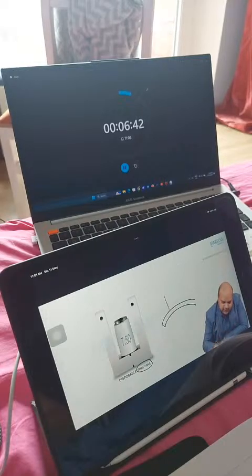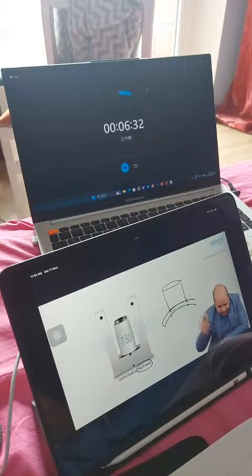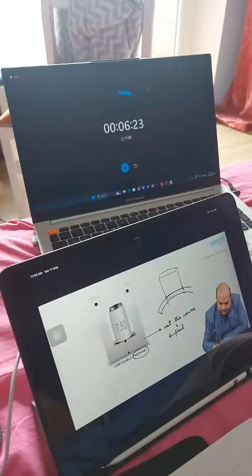So the trephine is placed on the cornea, and up to a certain depth, it is punched. Either penetrating keratoplasty or deep anterior lamellar keratoplasty, whichever way. So this part of the cornea, let's say 7.5 mm, is cut and removed. Am I clear to everybody? So trephine will cut the cornea. Okay. Then what do we do? We implant the graft cornea.